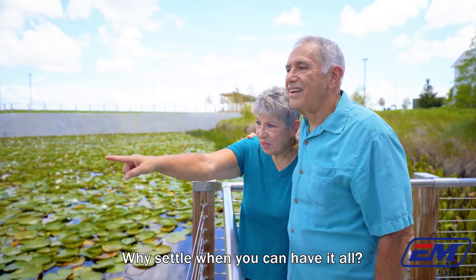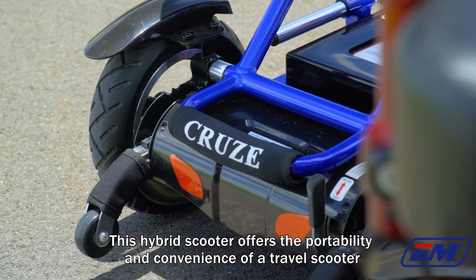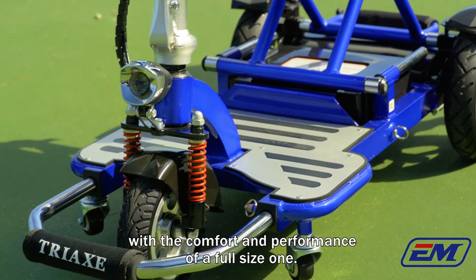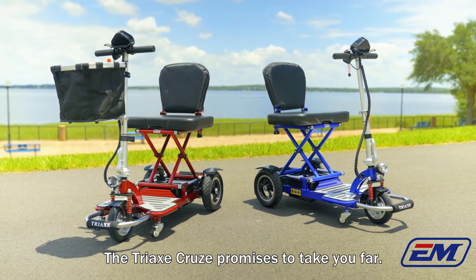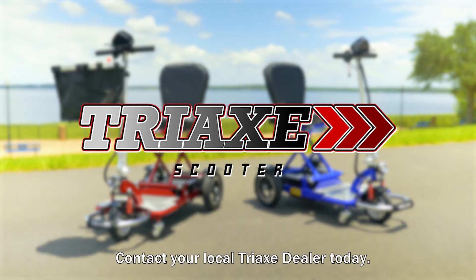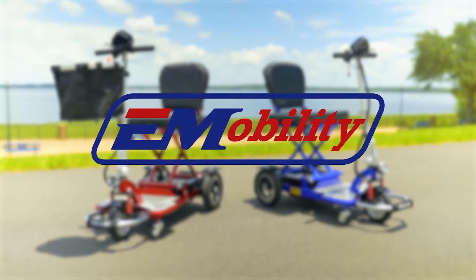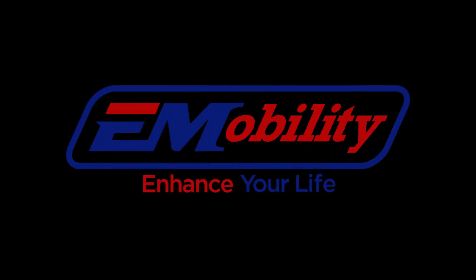Why settle when you can have it all? This hybrid scooter offers the portability and convenience of a travel scooter with the comfort and performance of a full-size one. The Triaxe Cruze promises to take you far. Contact your local Triaxe dealer today. Enhance mobility, enhance your life.